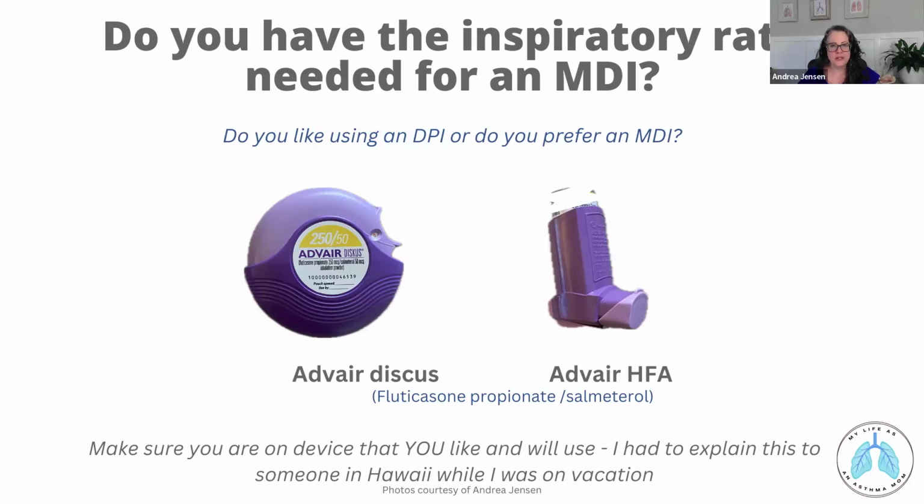She said, "Oh, I have that purple disc. I just really hate it." And I said, oh, and pulled up my cell phone, because I always keep a poster of the inhaler posters on there. I said, you can get the same thing in an inhaler form. And she said, "Really?" I said, call your doctor, see if it's covered, see if you can switch. I really hope she did, because what she was doing was really, really dangerous.